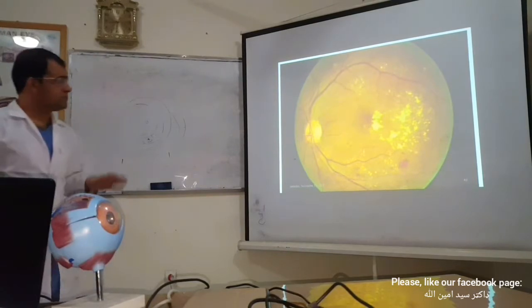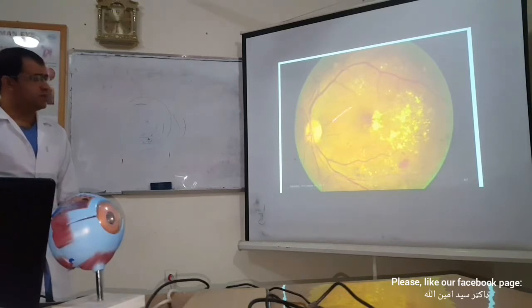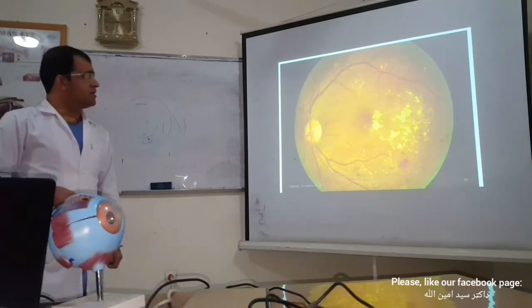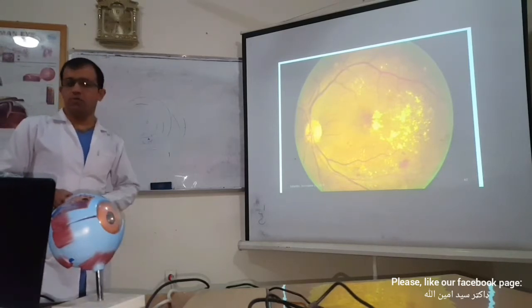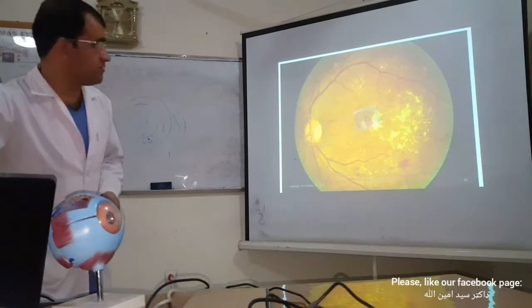And this is a kind of a form of diabetic retinopathy. You see the flame hemorrhages and also the dot hemorrhage may be seen. And these are all the exudates. We are again familiar with the diabetic retinopathy patients because most of our patients come with this problem, and for most of them we also advise our study.